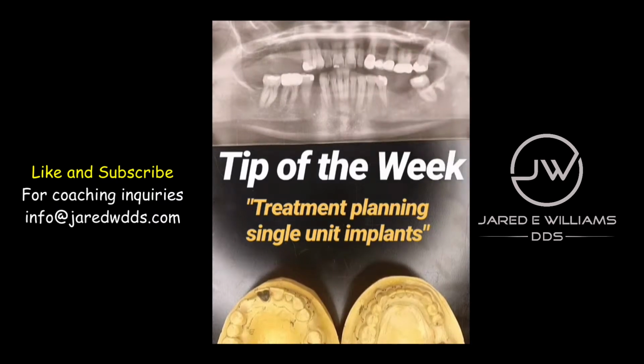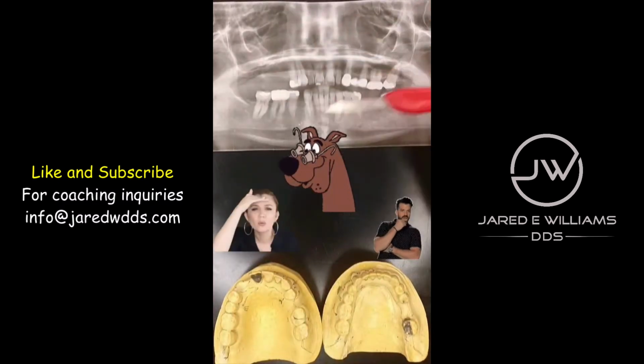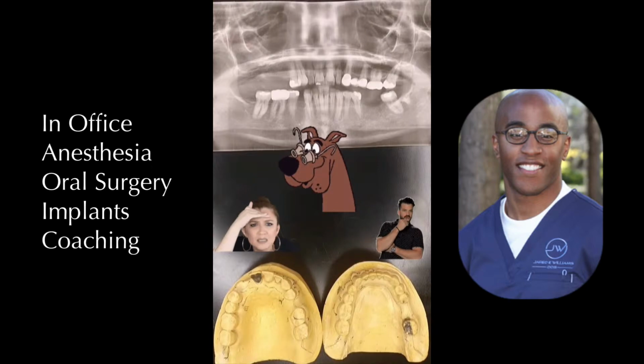It's a tip of the week, and today we're going to be discussing treatment planning specifically for single unit implants. So, the first thing you want to do is make sure you have their medical history. You want to ensure that there aren't any contraindications to placing an implant. The next thing I would like to do is evaluate all the imaging that you have.